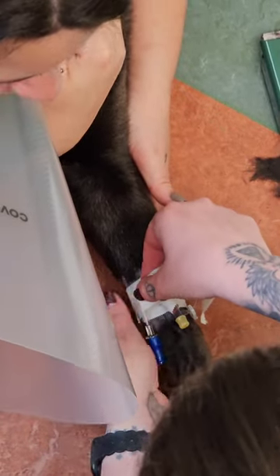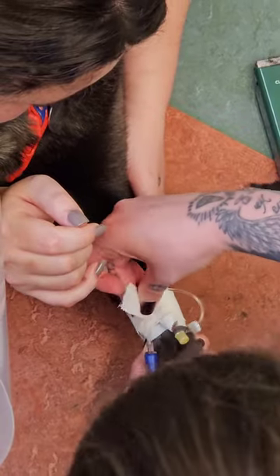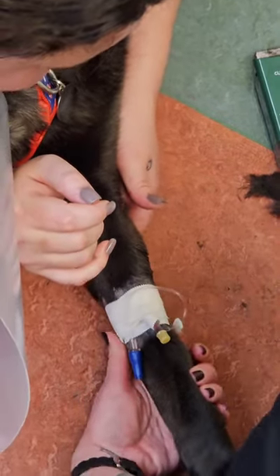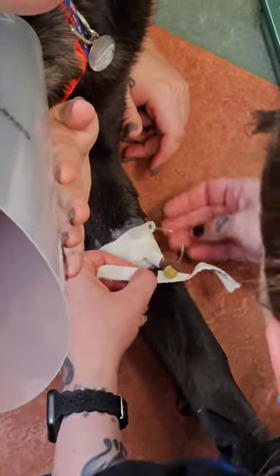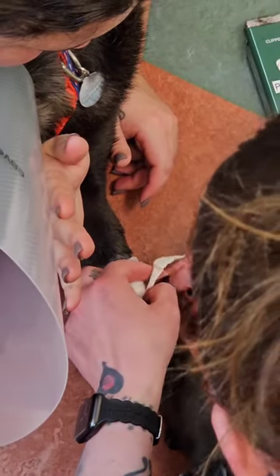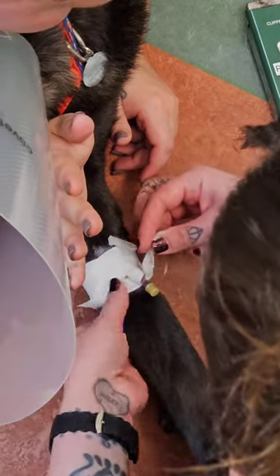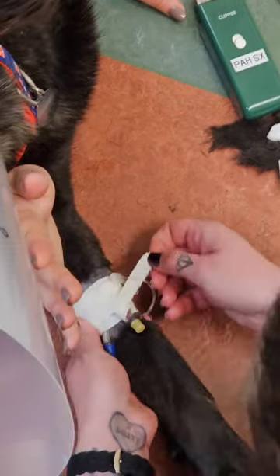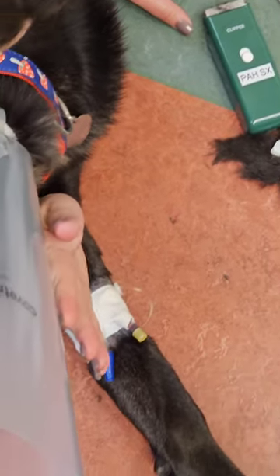Now she's anchoring down the t-set with another piece of tape. Never hurts to have an extra anchor. And that's it folks — successful IV catheter placement in a dog.